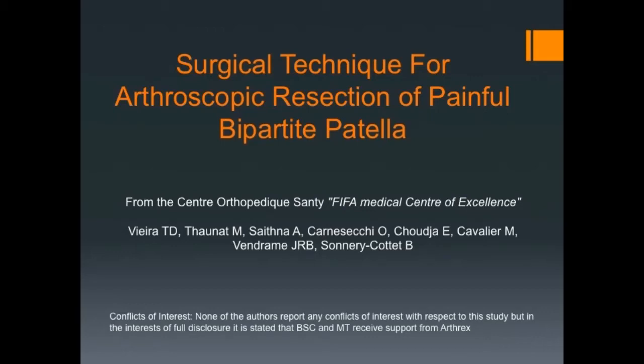This video demonstrates the surgical technique for arthroscopic resection of painful bipartite or tripartite patella.